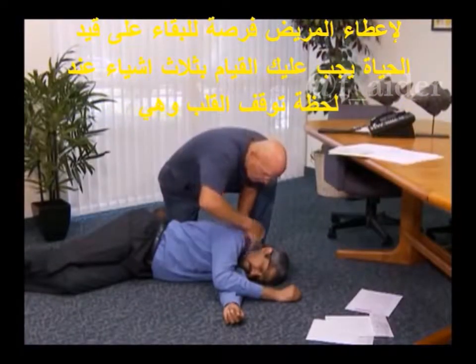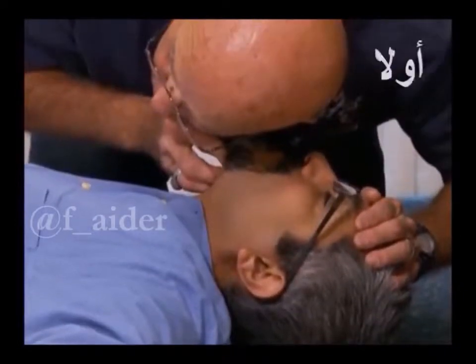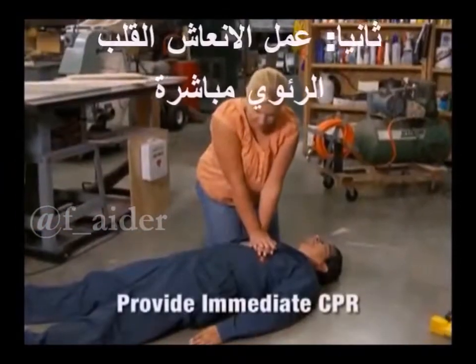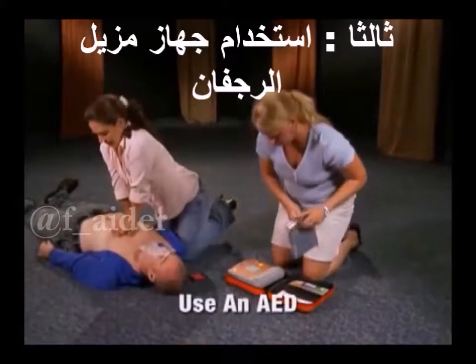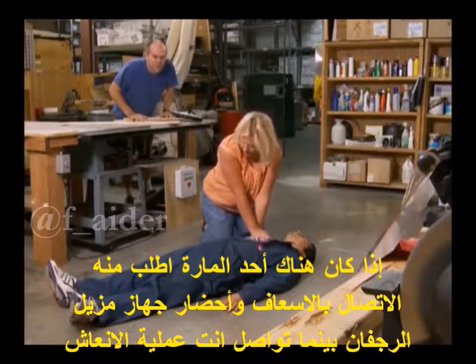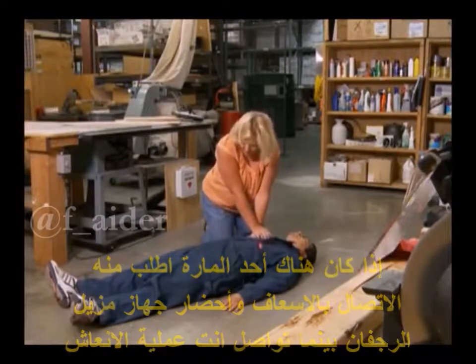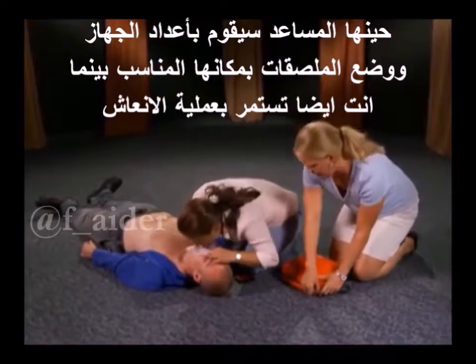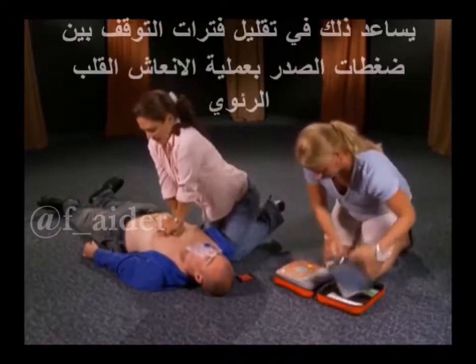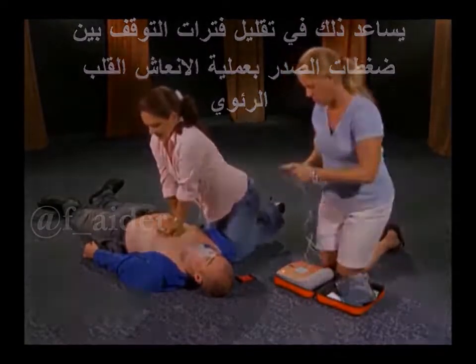To give a patient the best chance of survival, 3 actions must occur within the first moments of a cardiac arrest. First, activate the emergency medical services system. Second, provide immediate CPR. And third, use an AED. If a bystander is available while you provide the patient with CPR, have them call emergency medical services and retrieve an AED. Further, bystanders can set up the AED and apply the chest pads while you continue CPR. Overall, both of these bystander actions allow you to minimize interruptions in CPR.